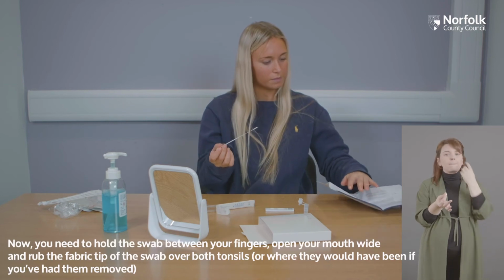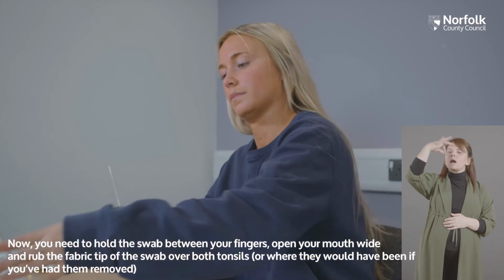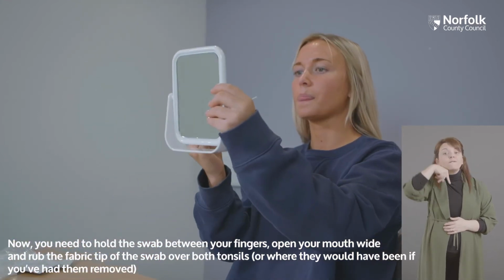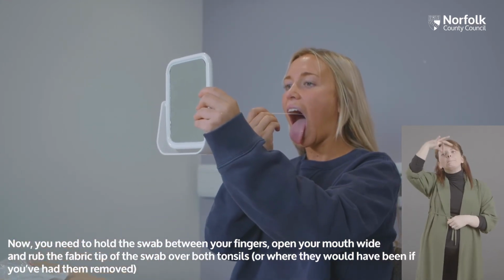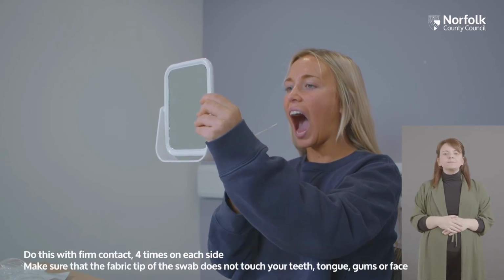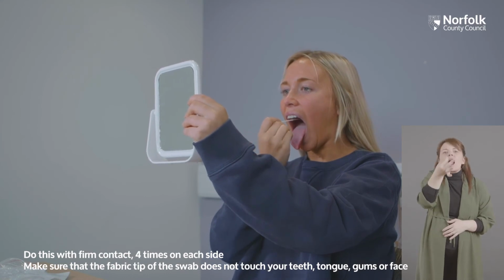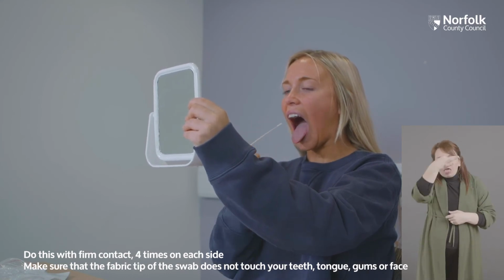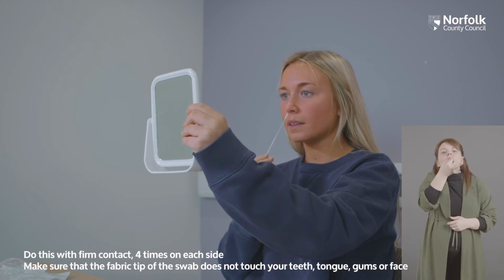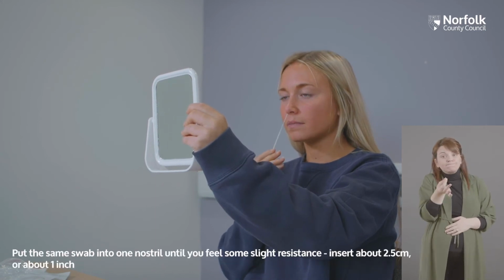Now, you need to hold the swab between your fingers, open your mouth wide and rub the fabric tip of the swab over both tonsils, or where they would have been if you've had them removed. Do this with firm contact, 4 times on each side. Make sure that the fabric tip of the swab does not touch your teeth, tongue, gums or face.